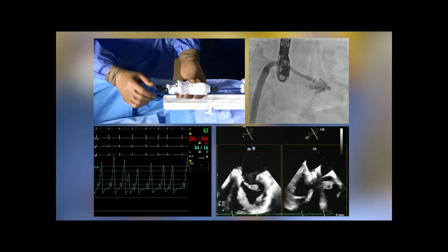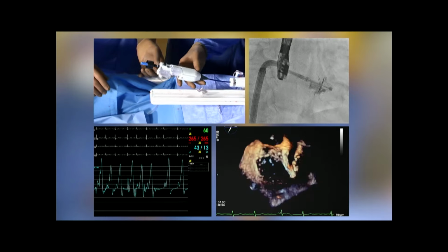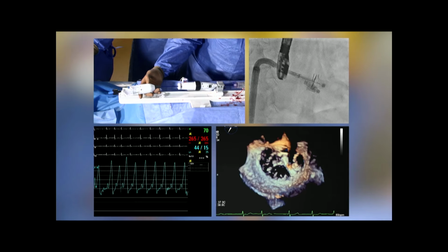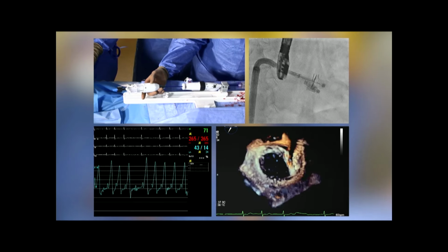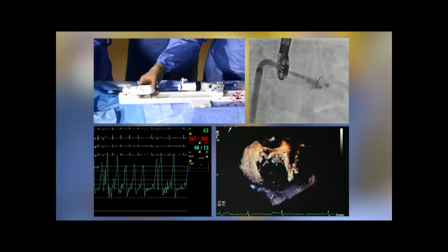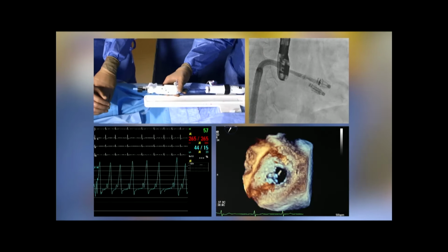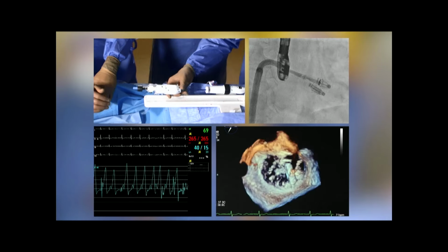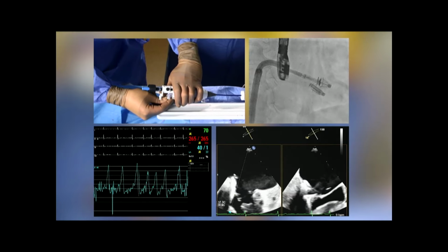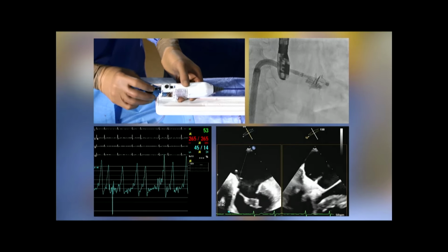And here you can see that we could be better. Let's bring up the posterior leaflet, please. Posterior's up. I go more clockwise. I think we have to come more clockwise. We have to bring up the anterior as well. Otherwise, it's difficult for me to turn. Now it's following, isn't it? Another 3D, please. So I turned to be more 12, 6 o'clock. Okay, good. We bring down posterior again. There you go. This looks very nice. Okay, so we have full leaflet in, but no annular tissue.